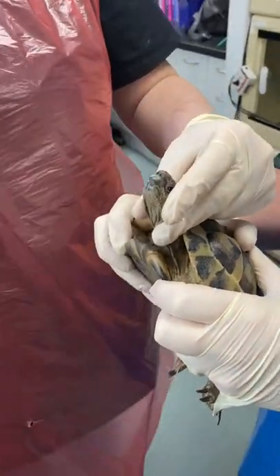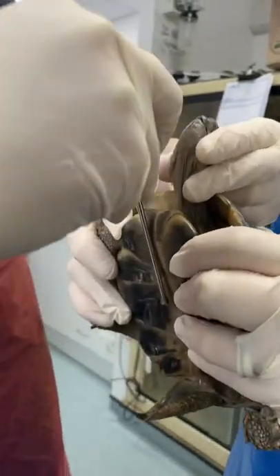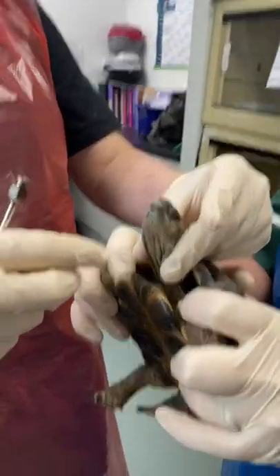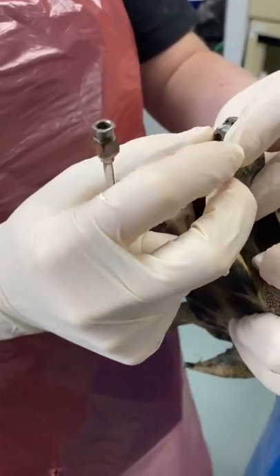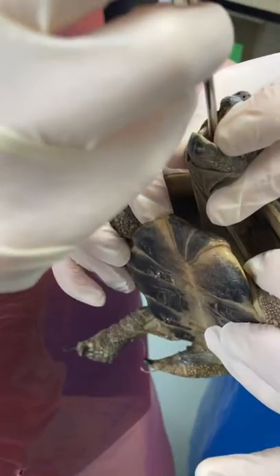When we're worming tortoises, we want to have our gavage tube ready. We want to measure it so it goes midway down the plastron, so you know how far to put it in. You've restrained your tortoise's head, gently open their mouth, pop your finger in the corner of their mouth so they can't close it.